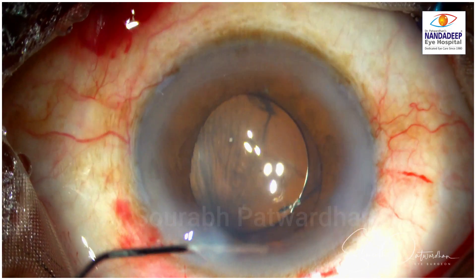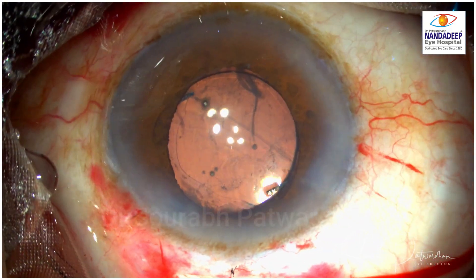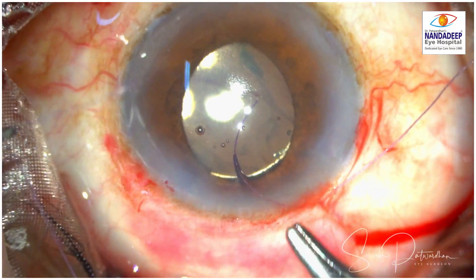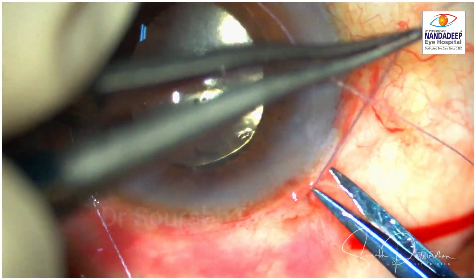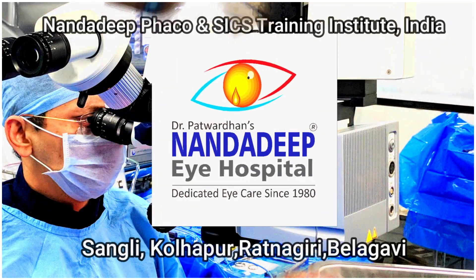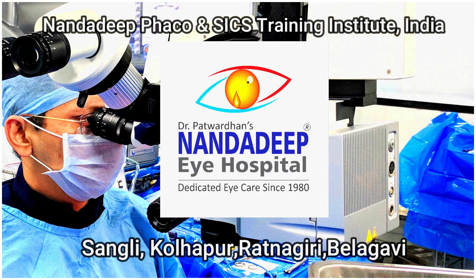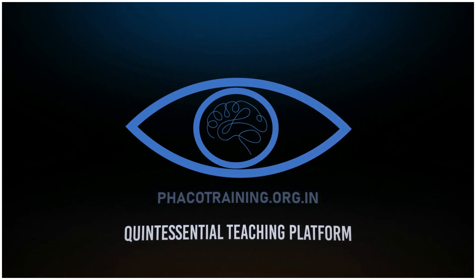And that's the end of the case. The AC is cleared of vitreous — I just recheck. You can close the conjunctiva back by glue, by tiny suture, or by cauterizing the conjunctival ends together. All in all it ended very well. The patient got 6/9 distance vision because of the scleral tunnel with hardly any astigmatism. So that's a nice way to manage a case of complication. A complication is not a complication unless it is not managed well. Thank you so much.